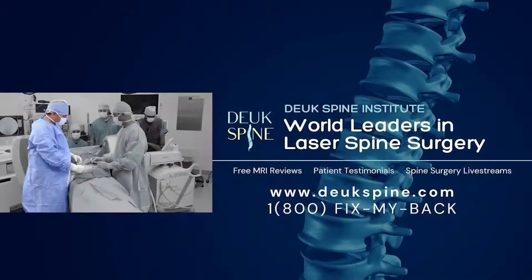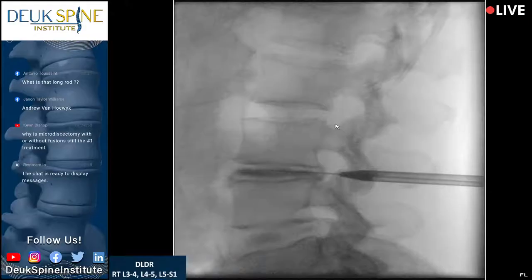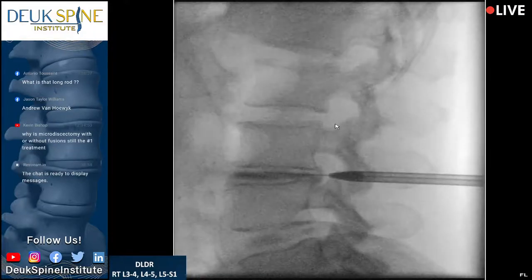All right. Well, welcome back. We've got our picture really almost perfect. We're off on orbit a little bit, but we're not changing anything. The dilator is sitting now at the foramen at the back of the disc. It isn't the x-ray, it's the anesthesia. It's good though, we've got plenty of time. It's only 1:30 in the afternoon.